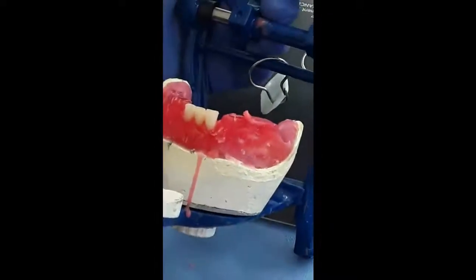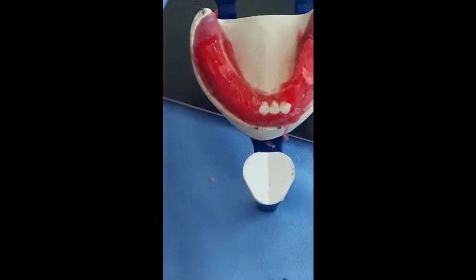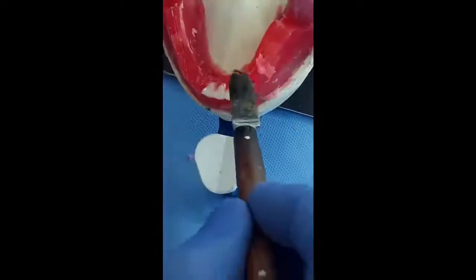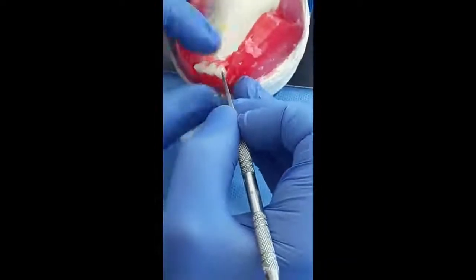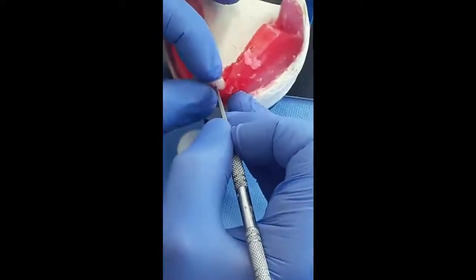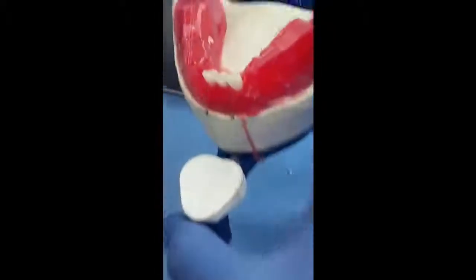Now we fix this tooth in the wax by melting the wax around it. Now we can see that the curvature started to move, and this will reproduce the original contour of the wax rim.